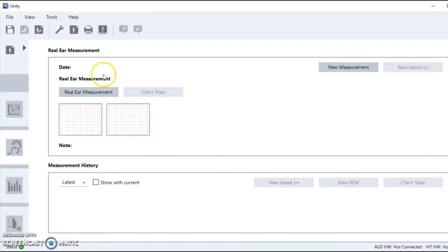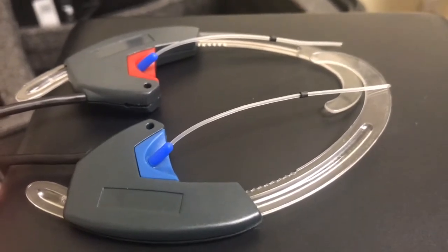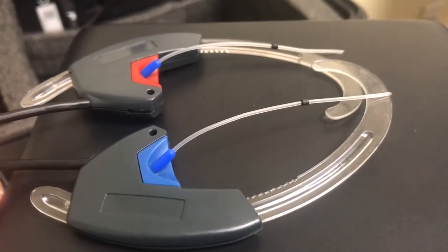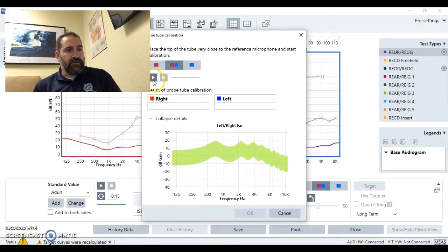We start with our real ear measurement. We use these little tubes that go into your ears and they measure — it's like putting a microphone down in your ear. They measure what's going on in your ear. So the first thing we have to do is calibrate the tubes. Then we put the tubes in your ear, and we've got to see what it sounds like in your ear when you're not wearing hearing aids.